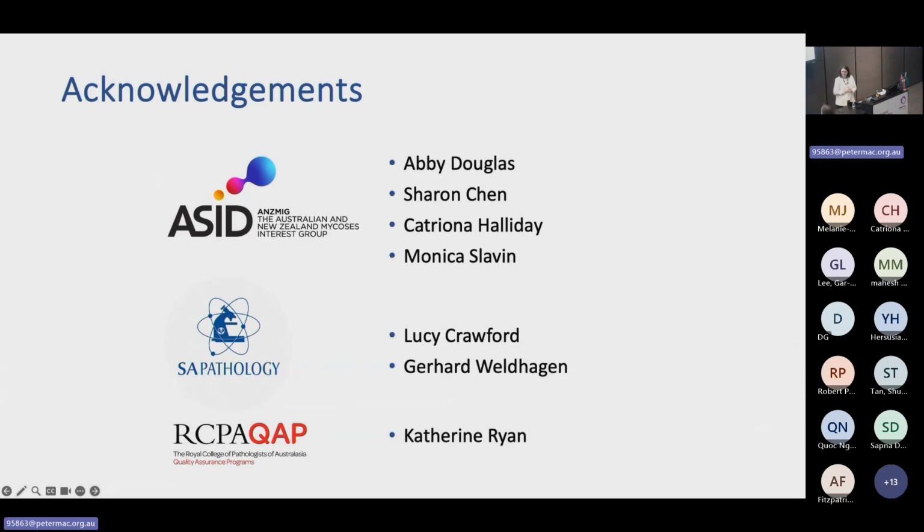Sarah, I saw you mentioning there was the panel with the Oz one with isavuconazole. Do you know whether any centres are using that? Yeah, I invented that panel. It's a Sensititre yeast panel. Katrina assisted with that as well, since she's online. It's almost the same as the YO10 panel, but we've taken out caspofungin, which is not reliable in the MICs it produces anyway, and we've put isavuconazole where it used to be.